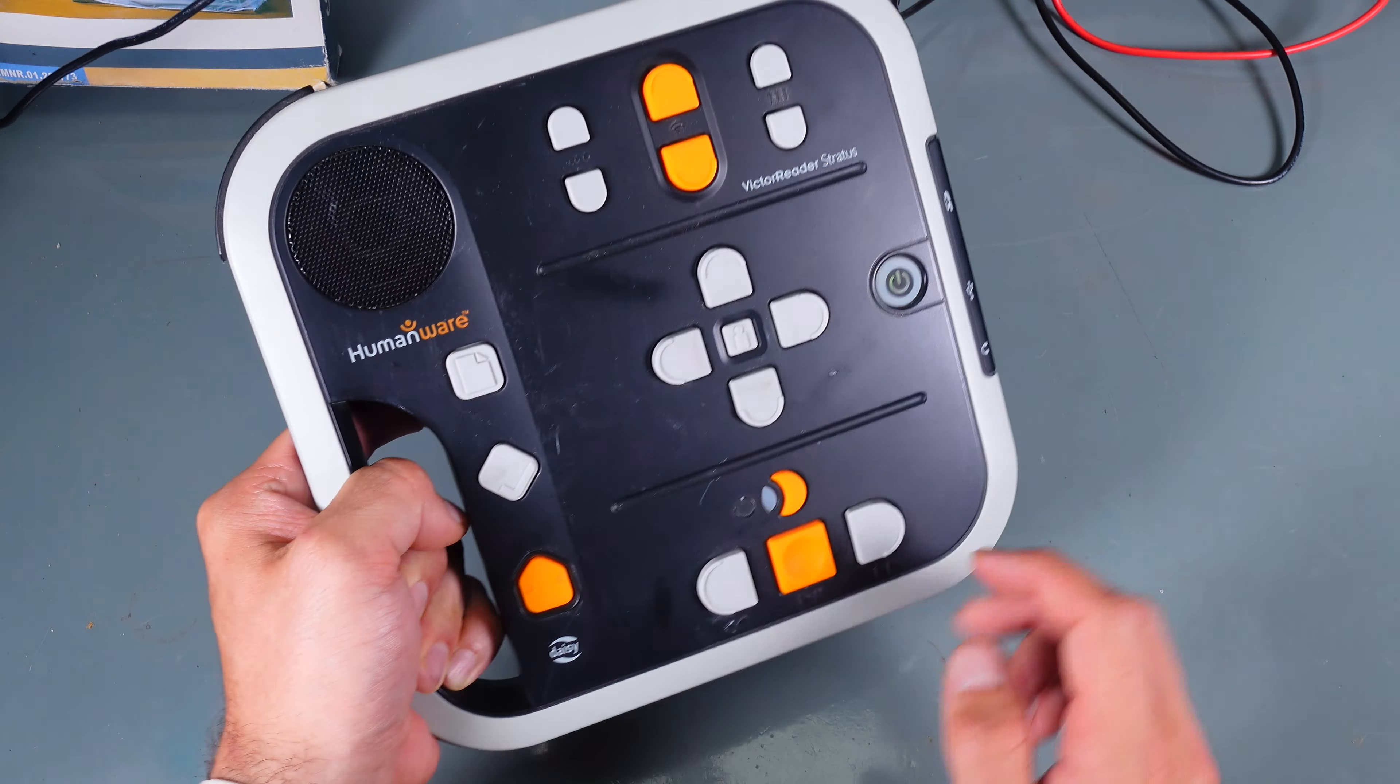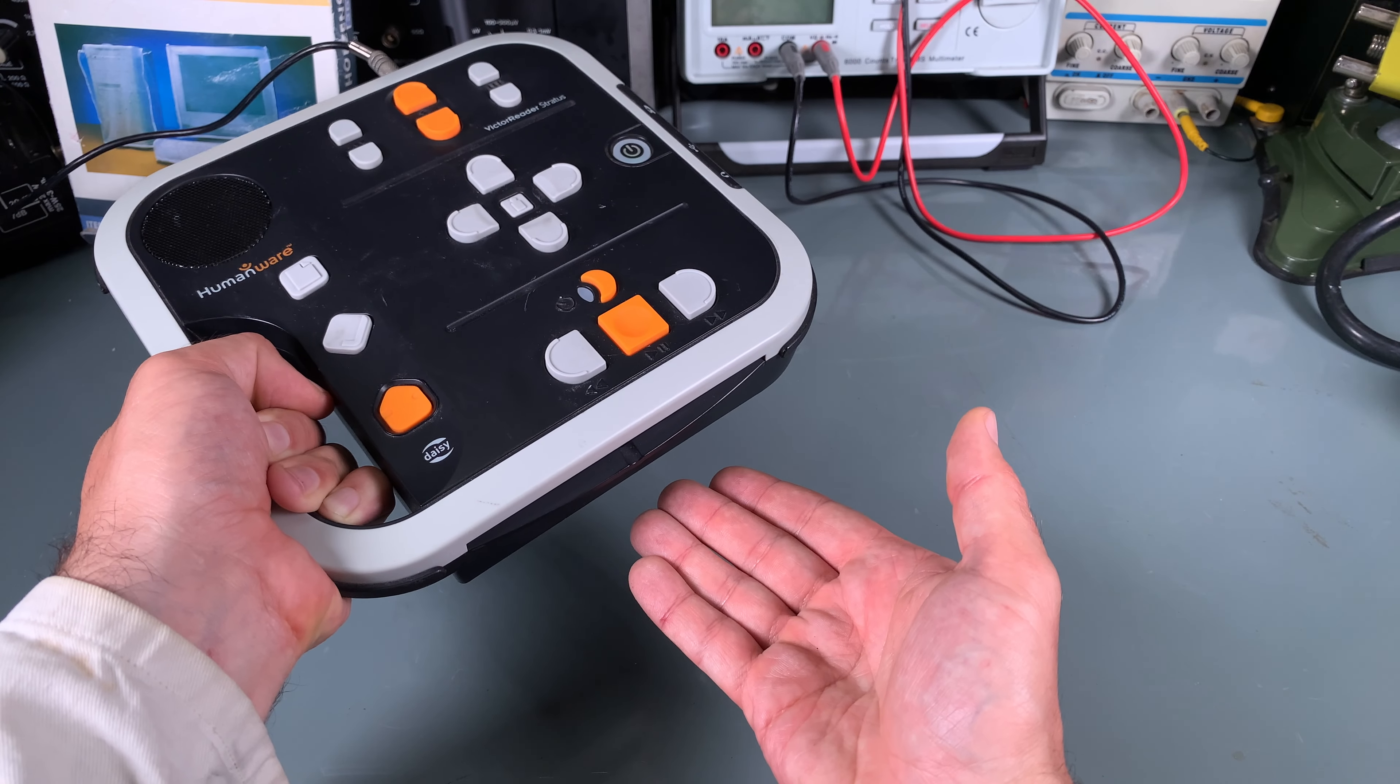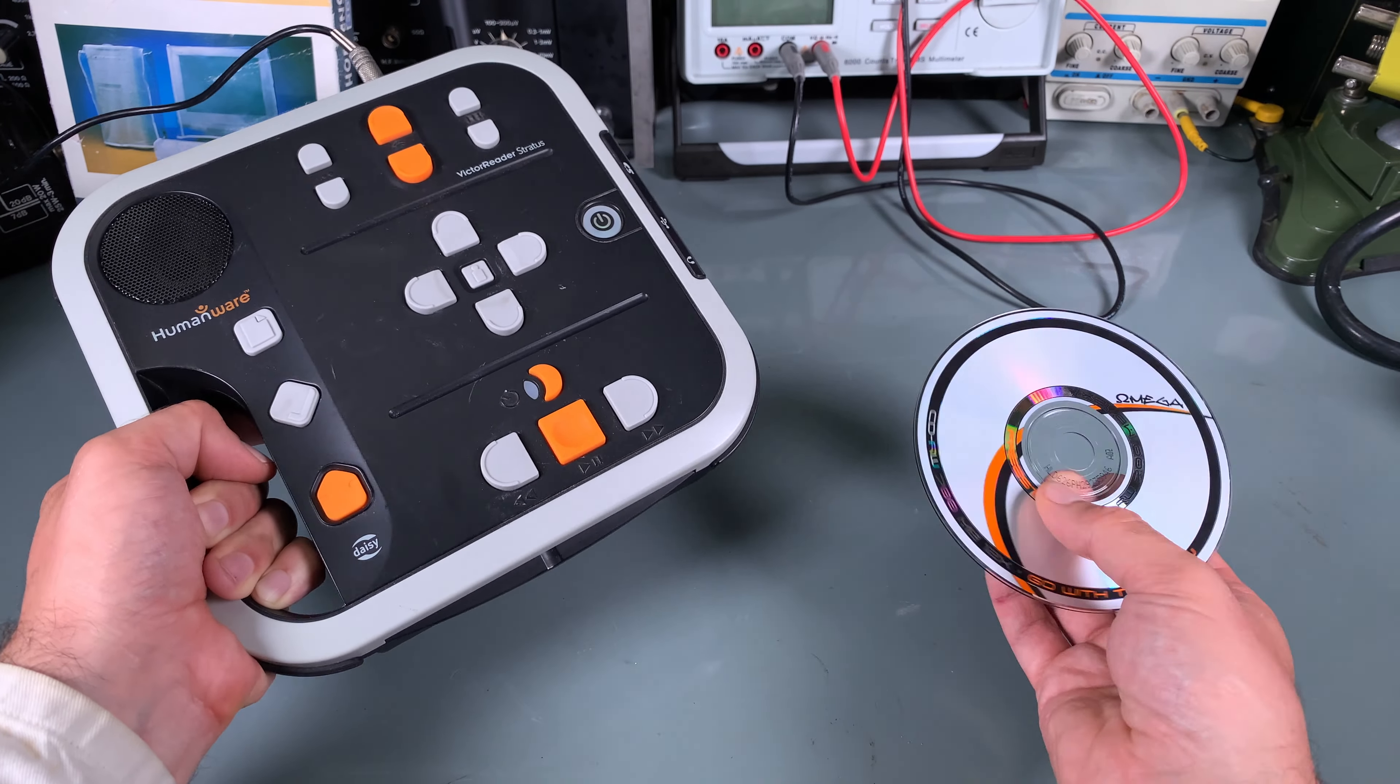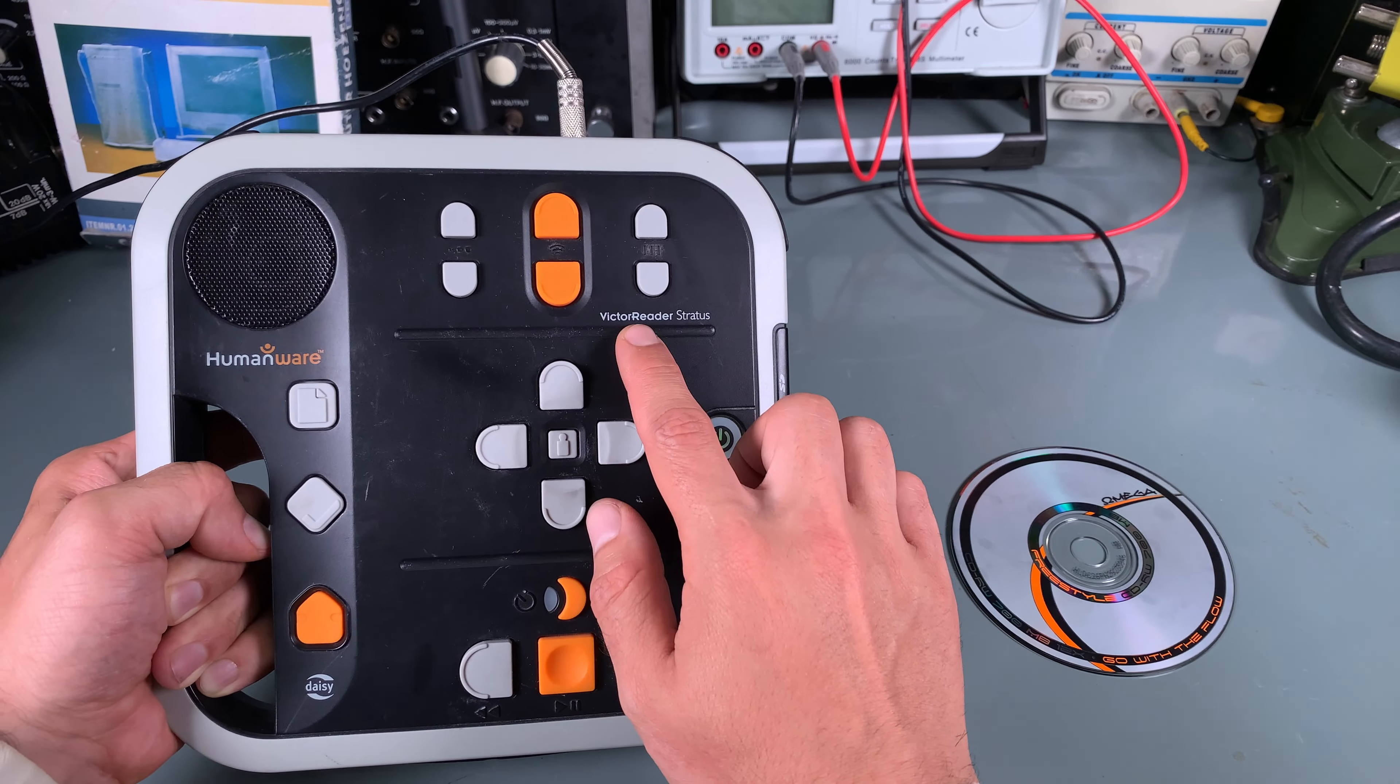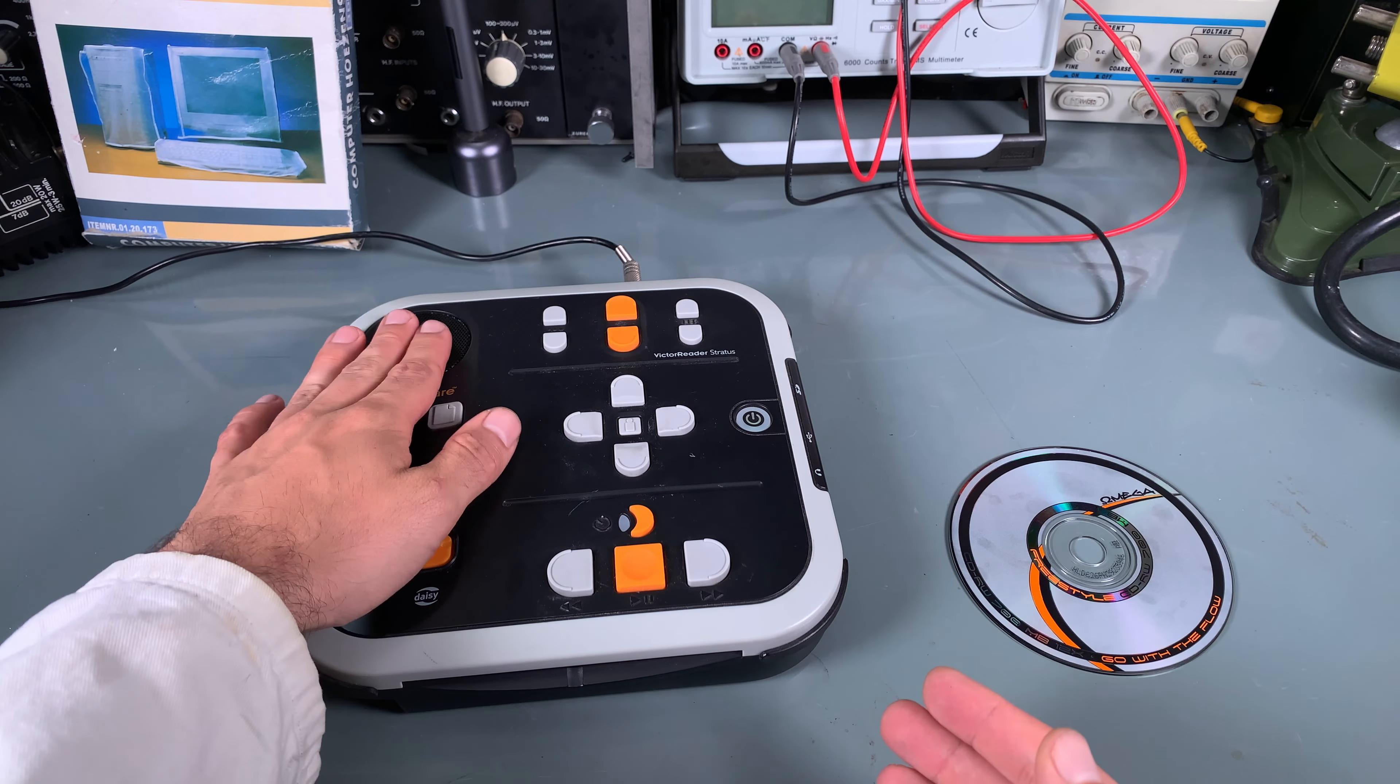This is how it looks. To eject the CD you go like this and it's giving it out. So a very nice device, the Victor Reader, and it can be used also for playing music.